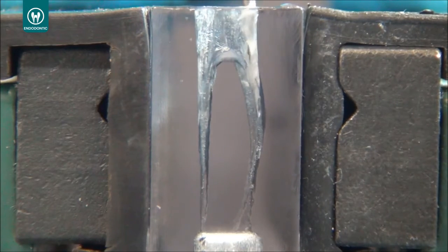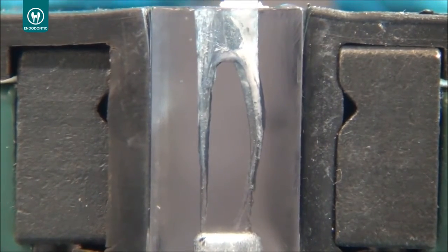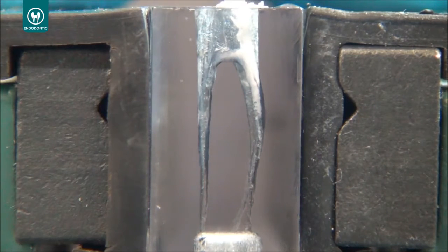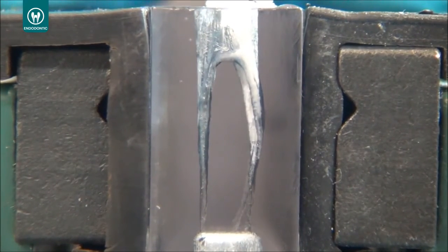So you have to put it inside the canal until the curvature, and work in rotation towards the mesial wall, if you are doing, like in the video, the mesial canals, or towards the distal wall if you are using it in the distal canal. The goal is to remove the dentin triangle and to open space in the cervical and middle third for the other files that will come.